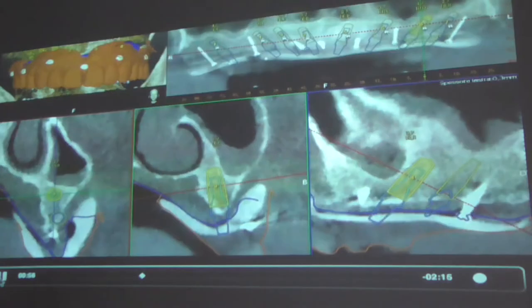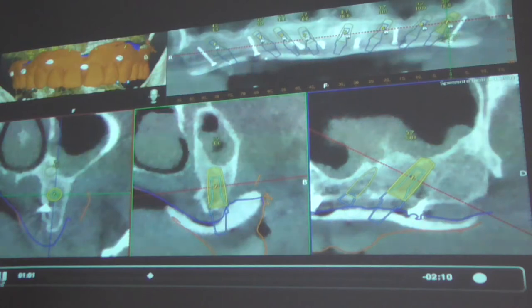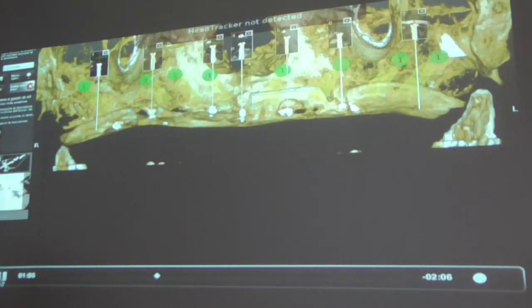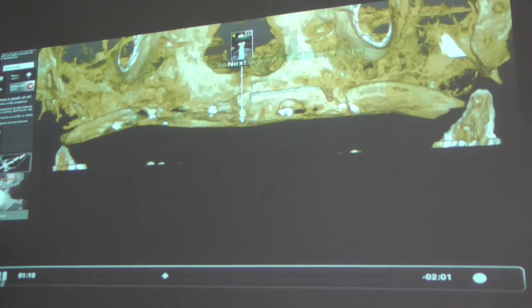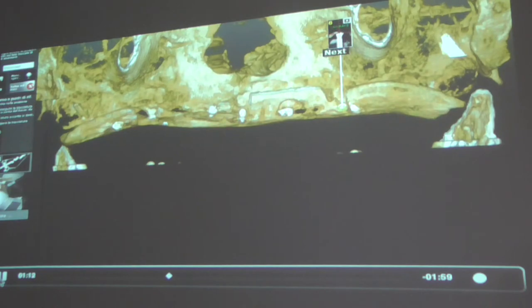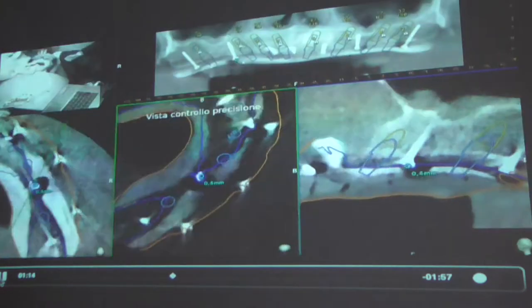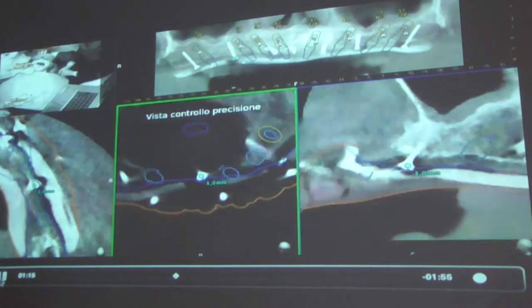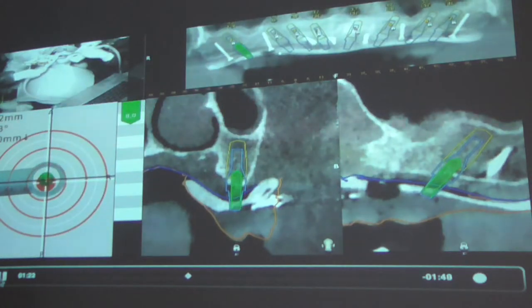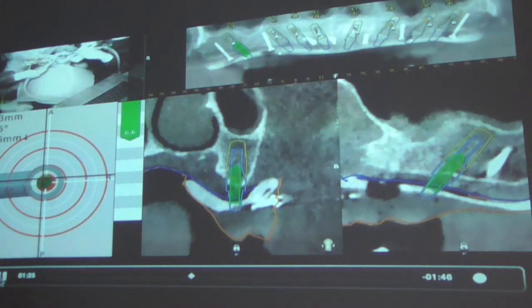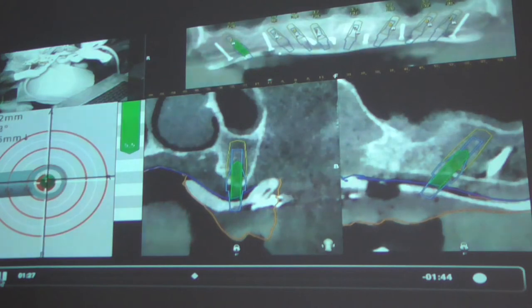After planning, I drill with the help of the navigation — it's mandatory to get precision, to be very precise. I'm using bone screws because it's very simple: you just touch it and the system recognizes the bone screws. It's five minutes of tracing and then you are done. You can follow exactly and precisely the planning.